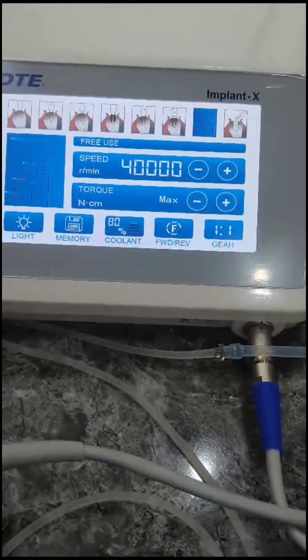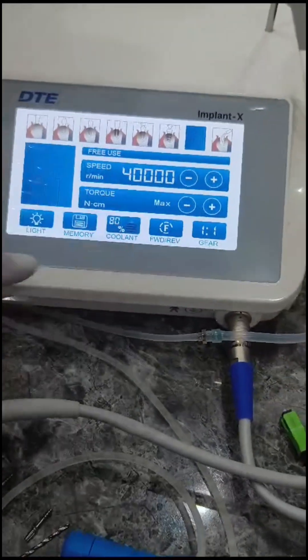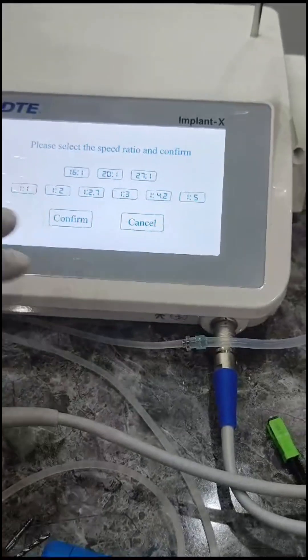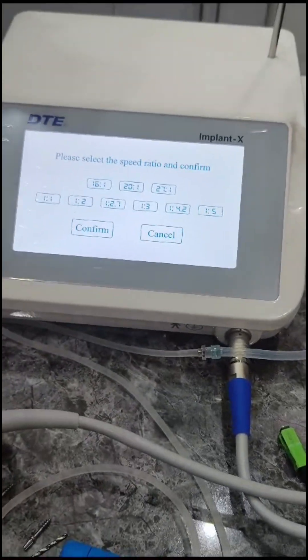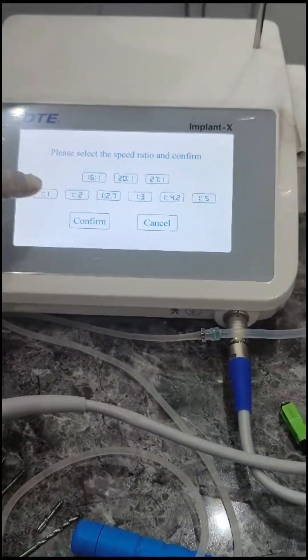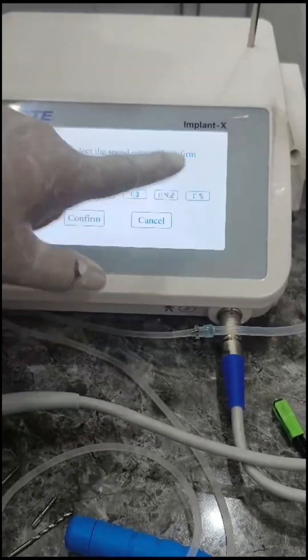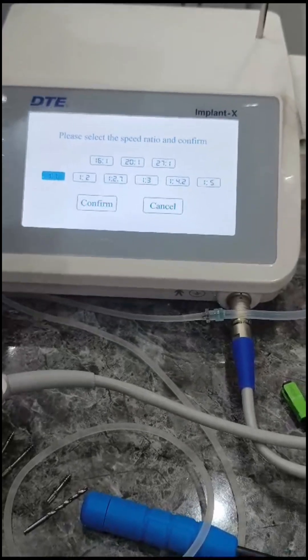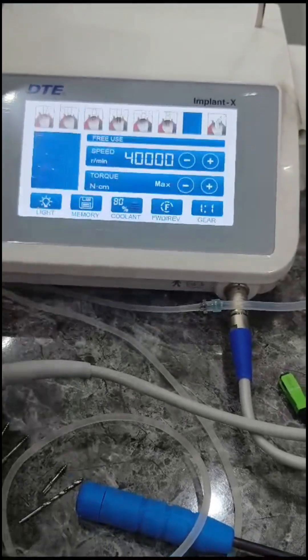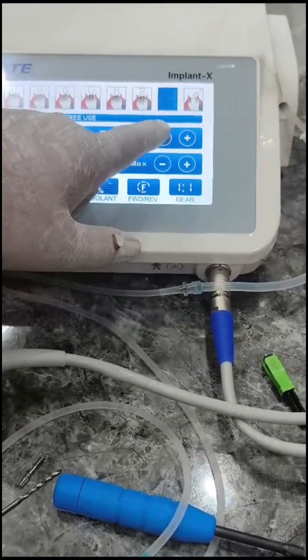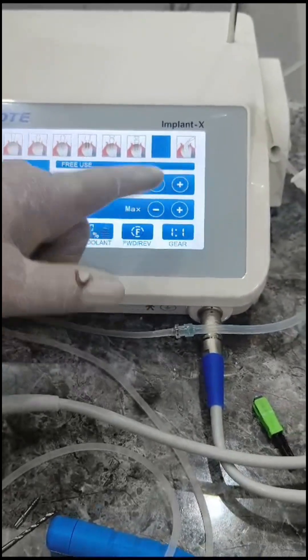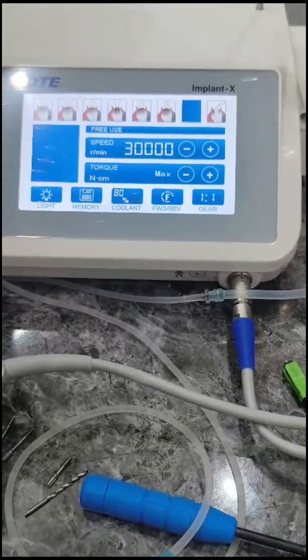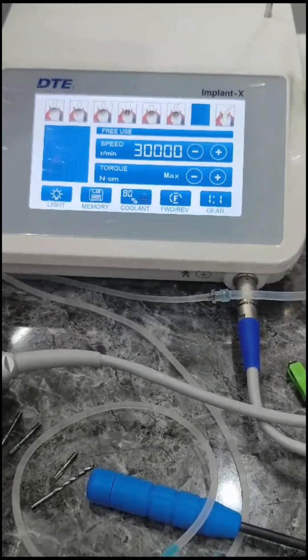Here is the Woodpecker implant motor. You can see 40,000 RPM, gear ratio 1:1. We can change the gear ratio, but since we are drilling into dense cortical bone, we usually prefer 1:1. Since this is a dried human skull, 30,000 RPM will be sufficient.